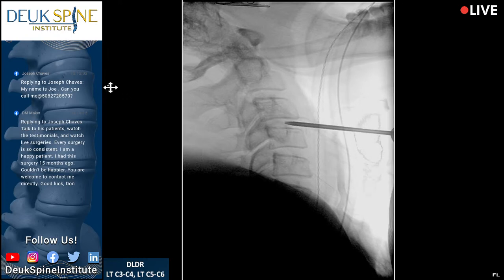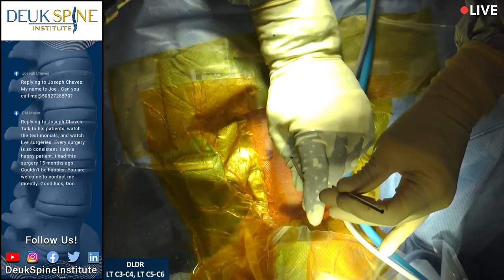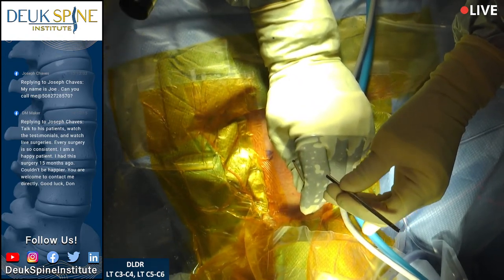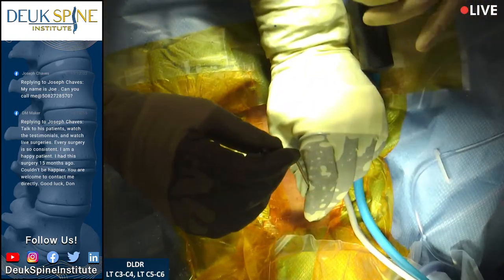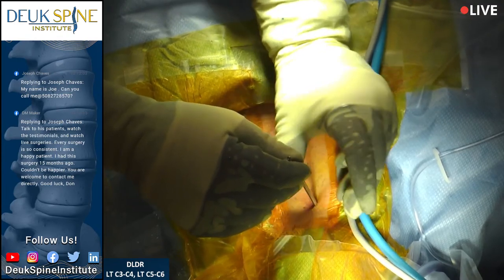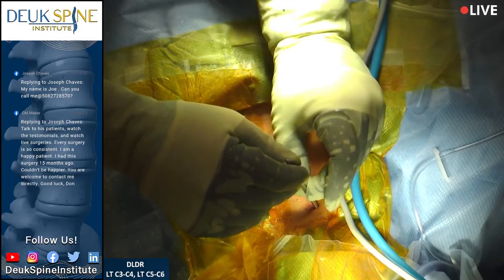We're at the front of the disc. I'm going to tap this in gently through the annulus in the front — and now I'm inside the nucleus. We've already done our discogram; I'm going to go to the back where the symptomatic tear is. People ask: aren't you making a hole in the front of the disc? No — we didn't cut anything. We're spreading the fibers. Unlike the skin, we don't make a hole in the annulus because it's fibrous — it's like strands of tight string and we're going between those strands.